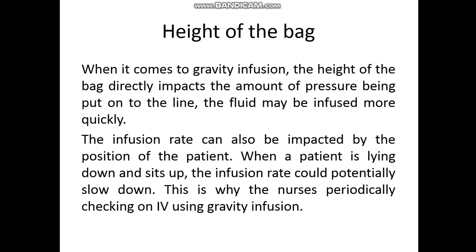After starting an infusion, a nurse will periodically check whether the medication is infusing at a normal flow rate, or whether there is any blockage or obstruction in the infusion bottle or medicine bottle. This is because any position change of the patient can affect the flow of the medication. So to avoid that complication or error, the nurse periodically checks the patient's infusions.